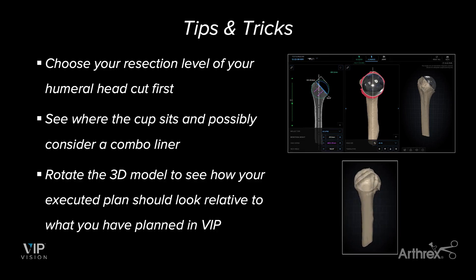You can see the anterior aspect and the posterior aspect. There's also a nice screen on the left side that helps you see what it looks like on a 2D CT scan, which is very helpful in terms of sizing. From there, there are different things you can do to rotate and make sure you're not overhanging your implant or perforating the cortex — different things you can check using the humeral head planning section.